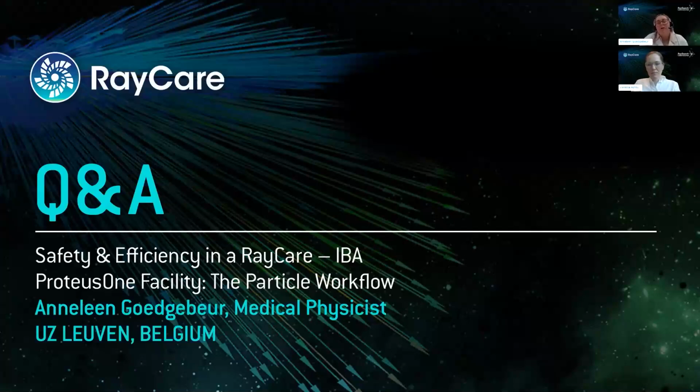Yeah, partial treatment, we do have that quite often, since it can happen for a variety of reasons, either an IBA glitch or machine, not a full breakdown, but some resetting that needs to happen, or a patient that's unwell that needs to be taken off the table. So we do have that quite commonly, and it's basically just closing down the session.